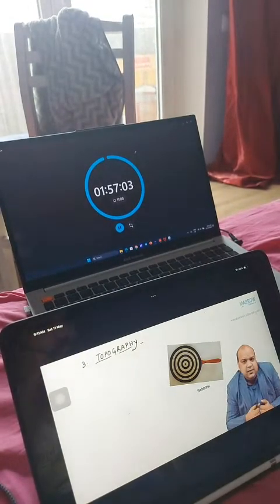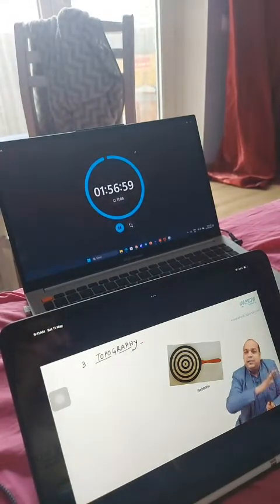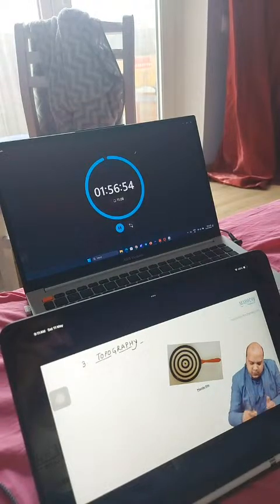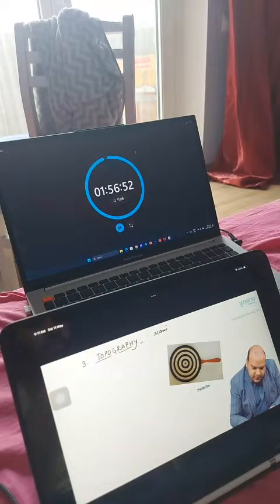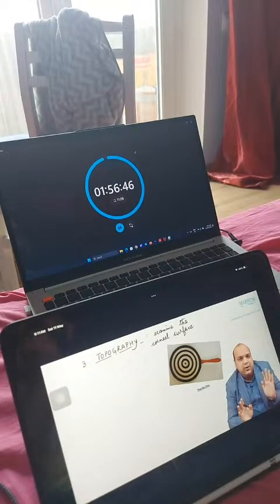So if you have ever seen a Discovery Channel or National Geographic Channel, everybody, they have topographic cameras to map out entire large areas, where there is a hill or a river or a flat area. So we are seeing the surface. Topography is done to examine the corneal surface, whether the cornea is smooth or there are some undulations in the cornea. Yes, as simple as that.